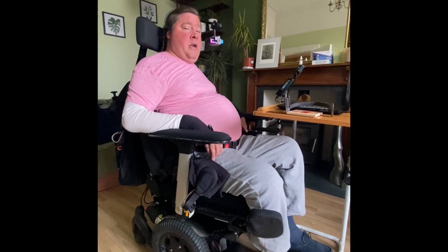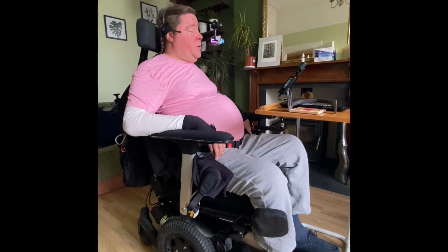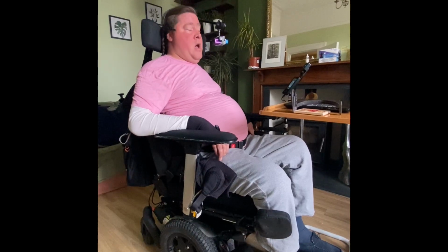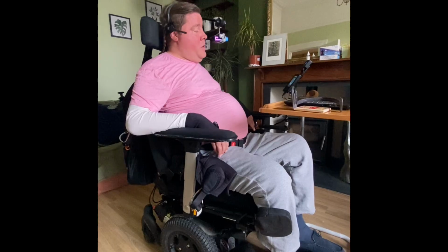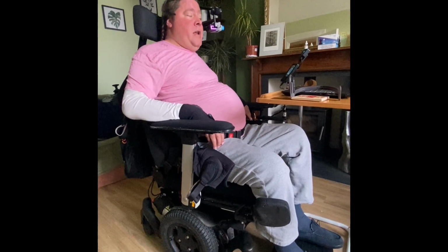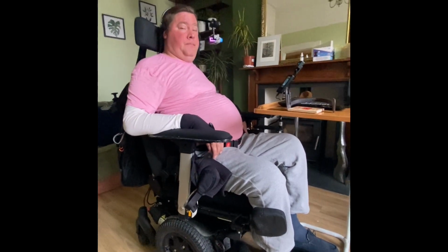The issue here is it's a single modality in that there is no voice control. So if I want to tilt my chair back, I have to go through a series of difficult manoeuvres and things like that. So I wanted initially to design a wheelchair that had multimodal inputs to make it as easy as possible for a quadriplegic to navigate a 2D space.